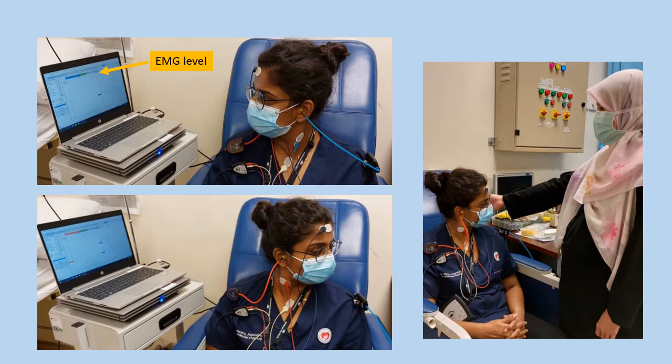The contraction would last up to 100 or 200 sweeps, or even fewer, depending on the sweep setting. Please do not use too many sweeps, as it may cause fatigue to the subject that results in unclear responses. In sitting position, if no or small VEMP response is obtained, make sure that the subject's body is straight and not bending or leaning against the chair. We instruct the subject to sit upright properly and retest the cVEMP recording.